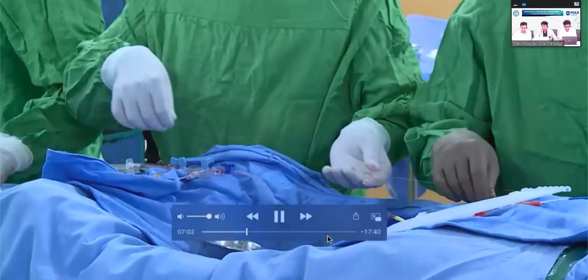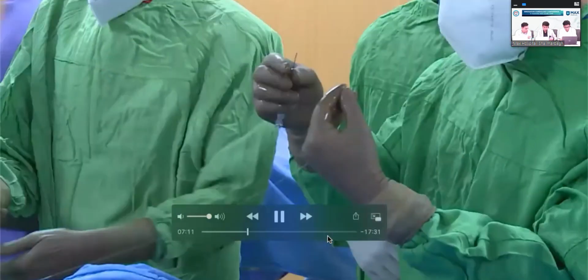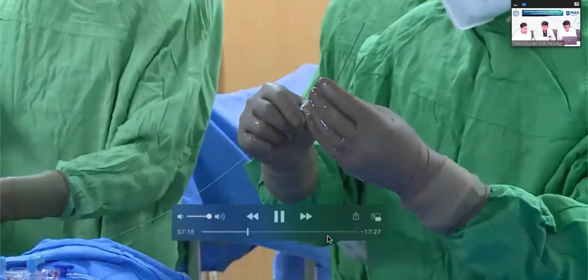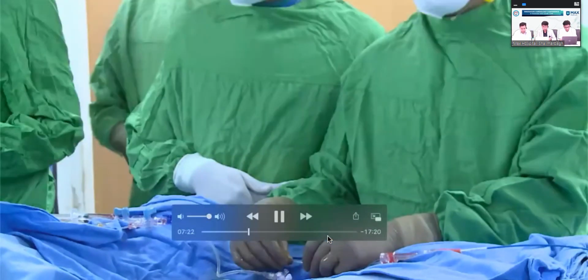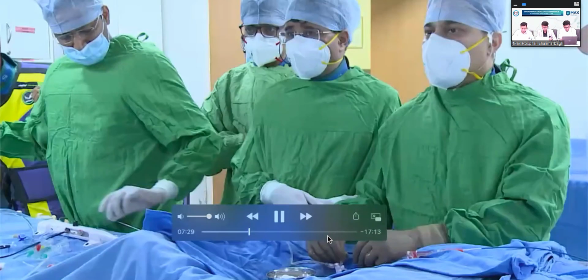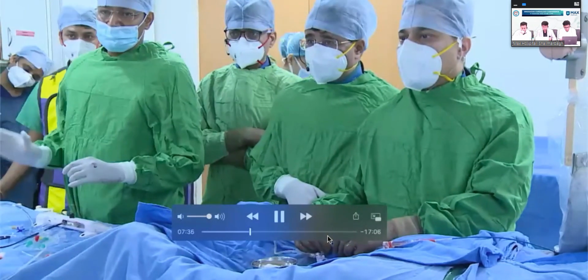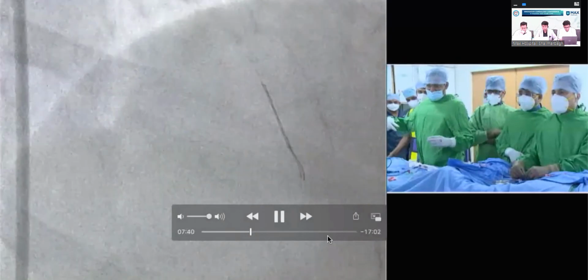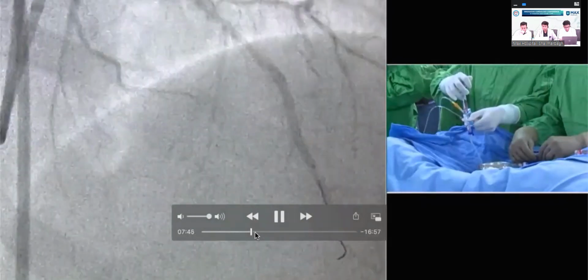We have decided to use a 1.5 millimeter burr, and this system comes as a preloaded system, so we need not attach the burr to the rota advancer. The approximate size of the distal LAD is 2.75 to 3 millimeter. The burr to artery ratio should be 0.5, that's why we are using a 1.5 burr in this case. If needed, we can upgrade to 1.75. So now we have the rota wire inside the distal LAD, in the distal segment.